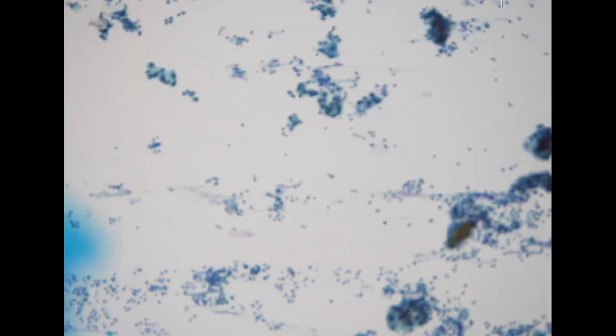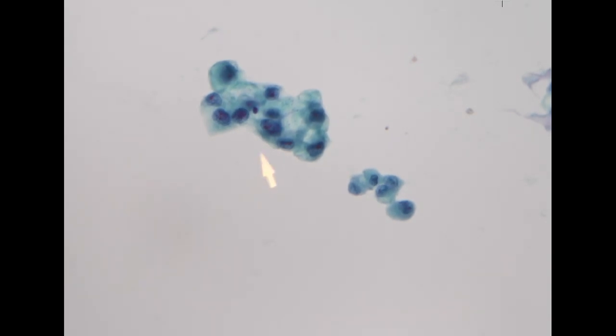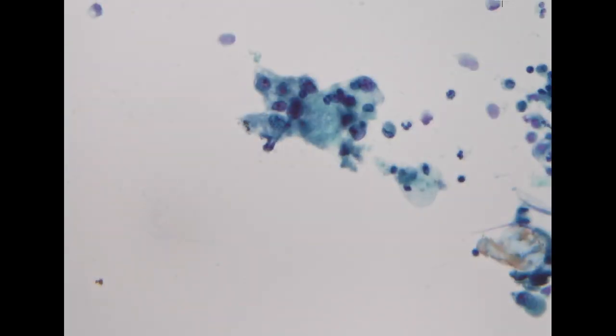So this is adenocarcinoma. We go to a flattened area, we do see quite prominent bubbly cytoplasm. So this is compatible with clear cell adenocarcinoma of the gynecologic tract.